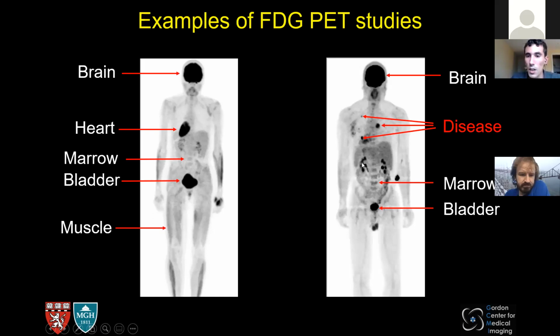Okay, these are the kidneys here, so this is completely normal. But there is something here that you can also see, I guess, that is located in the arm of the patient. And it's not a tumor. This is actually something that can happen when the injection of FDG that is done in the arm hasn't worked well, and then you have FDG that is under the skin, basically. That makes a big area of uptake. But of course, people who interpret those scans know that, and they will not think that this is a lesion.